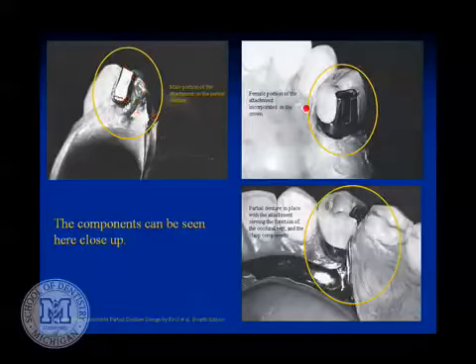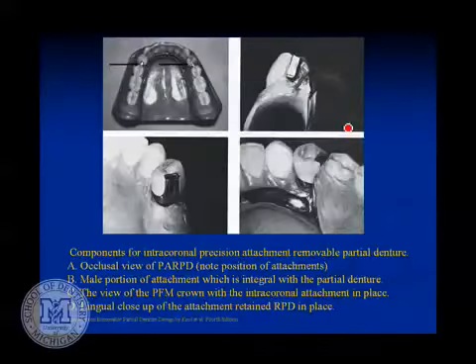So when the two go together, you've got the male and the female together, partial denture in place, no lingual reciprocal arms, no buccal clasp arms. And the bottom of the attachment is the occlusal rest, and because of the precise fit, it is both the retentive component and the reciprocal component at the same time. So again, here's our model with our two attachments on it.